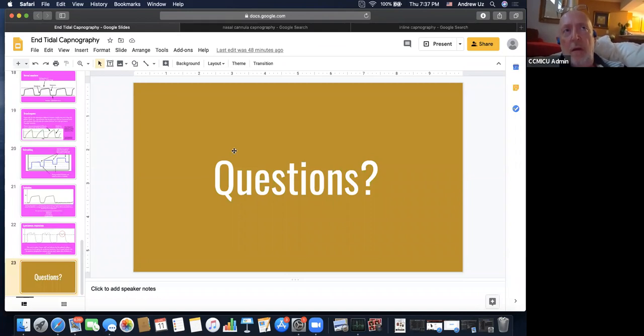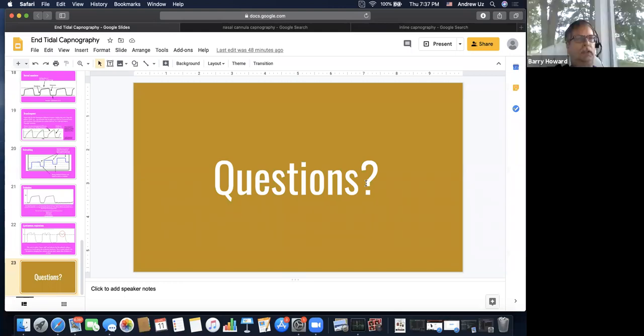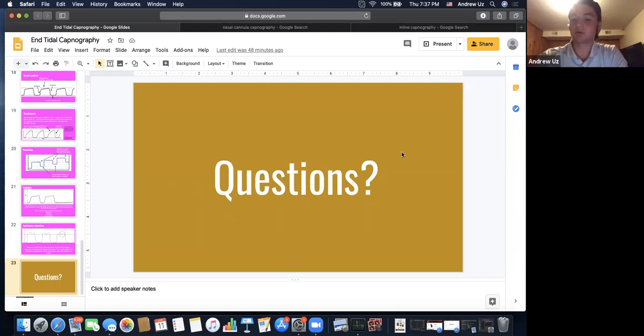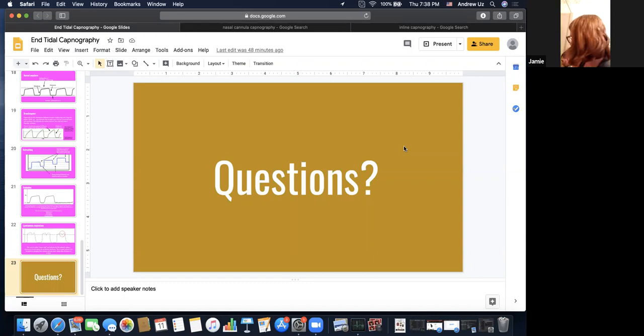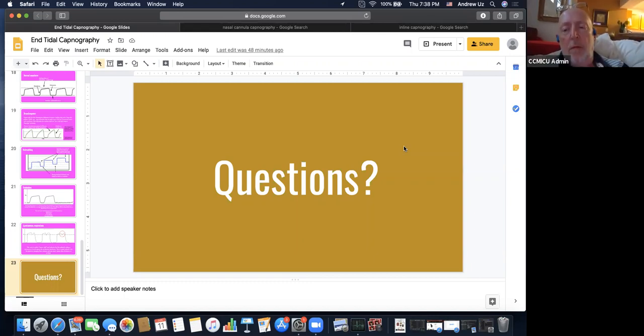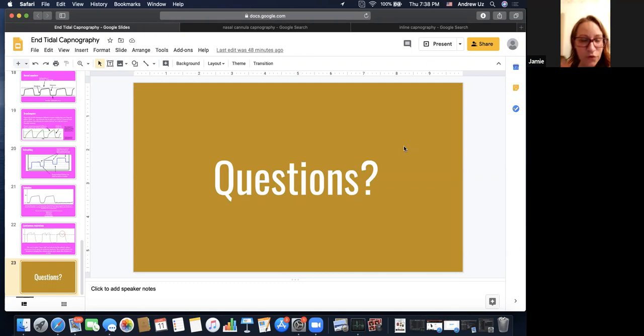It is great. I'm almost positive I had a question on it on my National Registry exam. Yeah, I'm sure you did. It is a BLS skill. Is there end-tidal on the LifePack 12s in the ambulance? Yes, the old ones have it. So then, if it is an approved BLS skill, that would be your opportunity to use it.